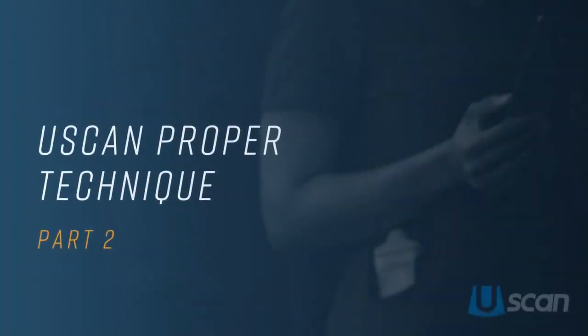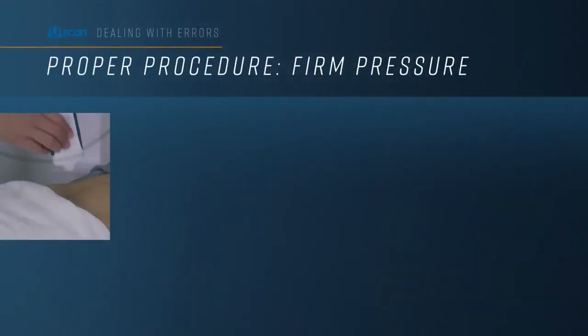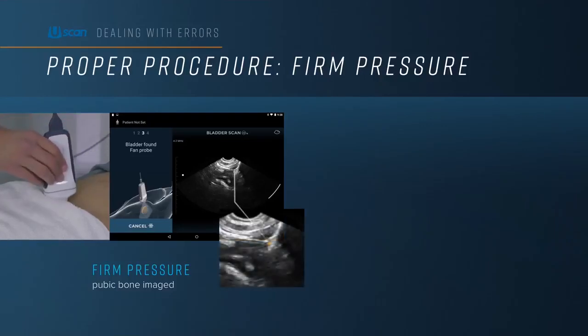To improve the accuracy and reliability of the final volume measurement, we will look at steps that help the user identify and eliminate certain potential user errors. As seen in the video, use firm but not excessive pressure when applying the probe to the patient. This will significantly help the USCAN identify the bladder by locating the pubic bone.